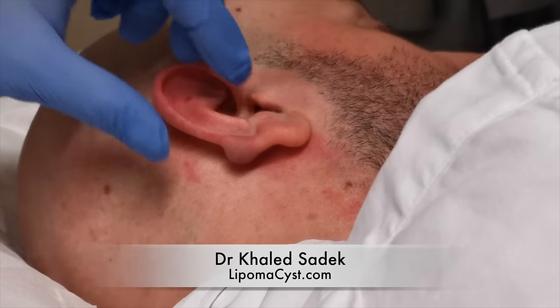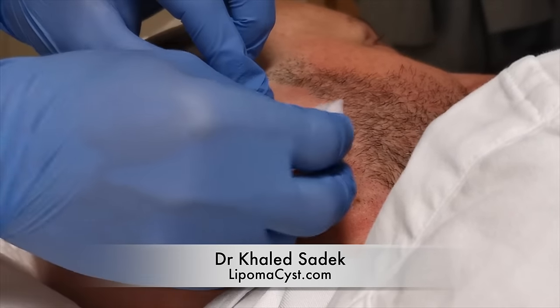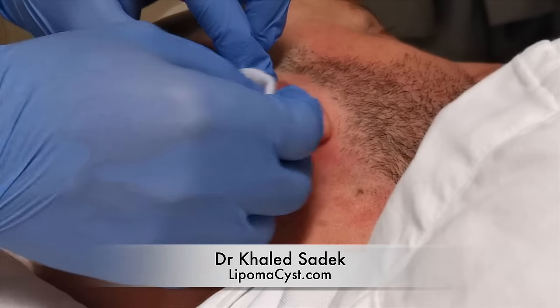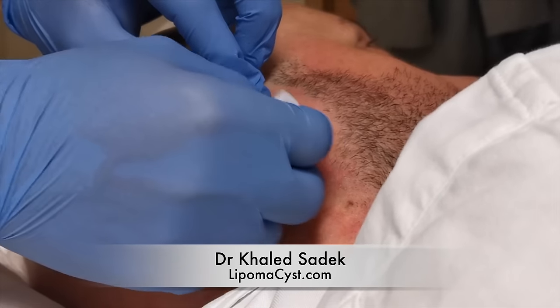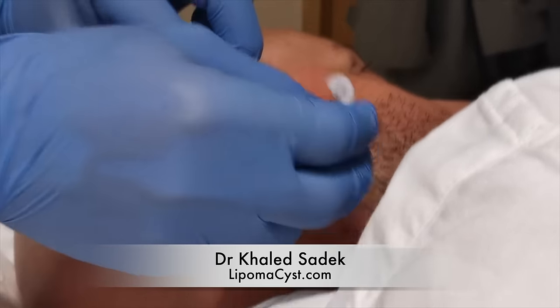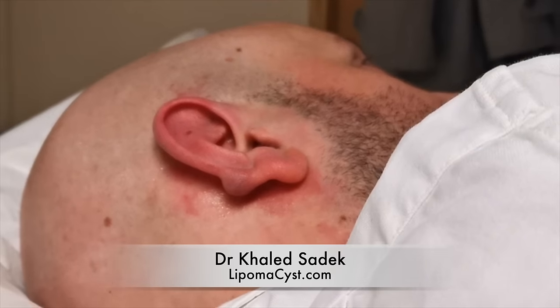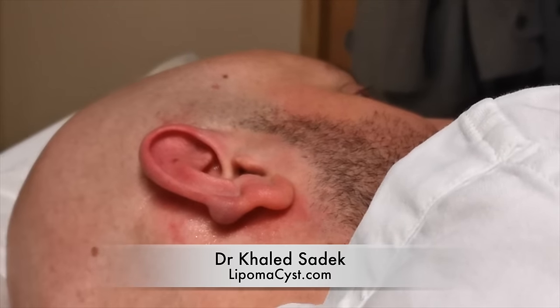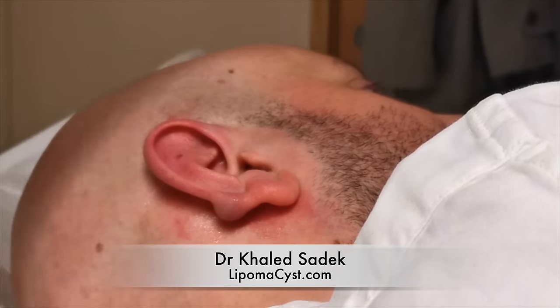So what I'm going to do first is just clean this cyst. Next up, I'm just going to put this drape on. Apart from covering your face, it might feel a little bit uncomfortable — if it does, let me know and we'll lift it.